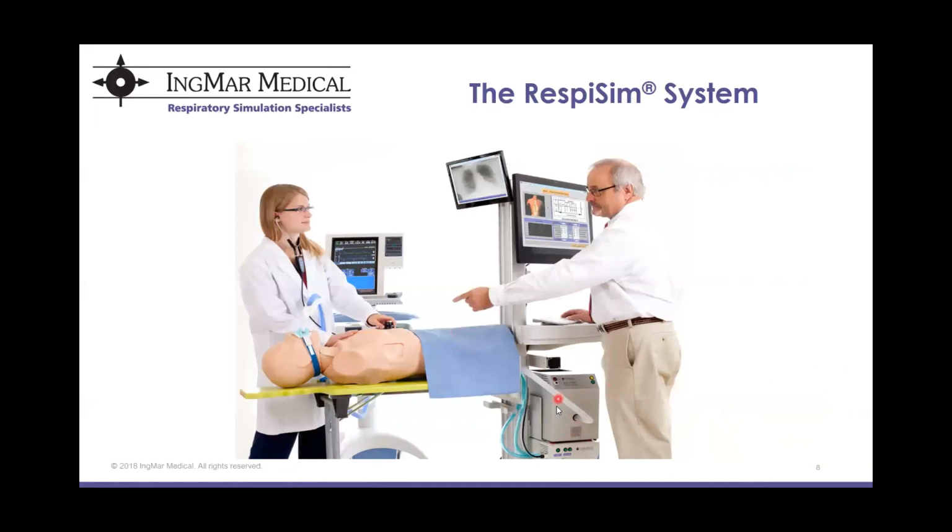And so there's another part of that question that I wanted to address quickly, and that's asking specifically about the chest rise. So we are detecting all of the flows, pressures, and volumes here with our simulator, and then we are correlating those with the appropriate chest rise for the mannequin. So your chest rise will be realistic to the scenario that you're running.